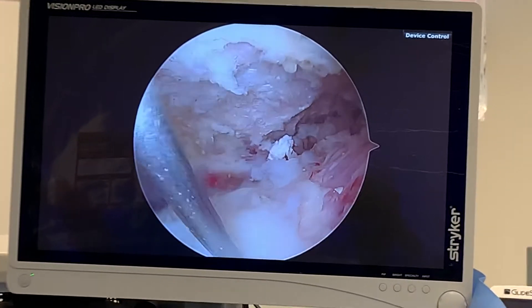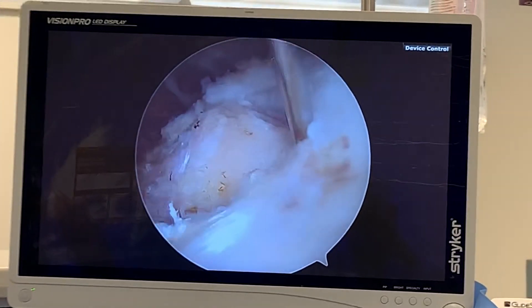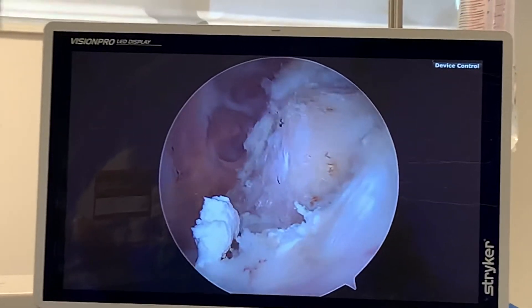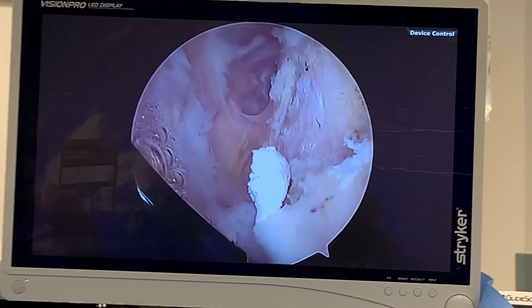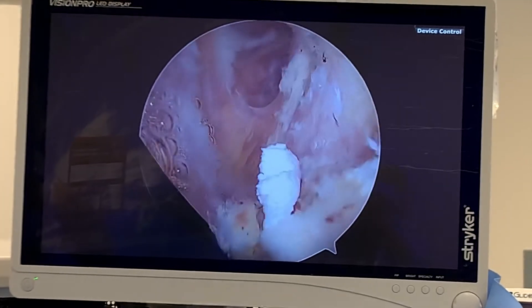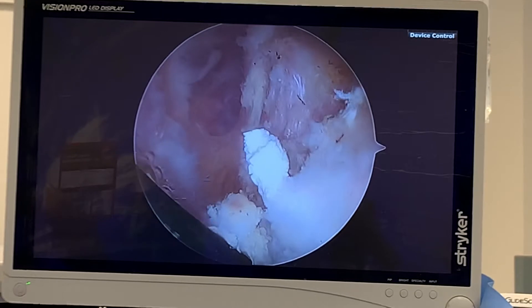I knew this patient had a rotator cuff tear. There was also a small calcification on the x-ray, and that's what we're looking at now. I just wanted to show you what calcific tendonitis looks like — it looks like that, it looks like toothpaste. You can see that right there.